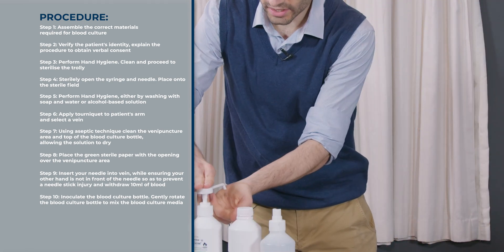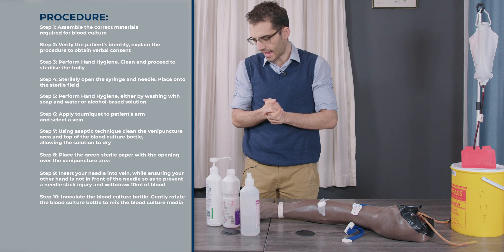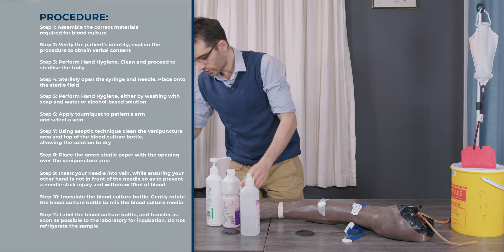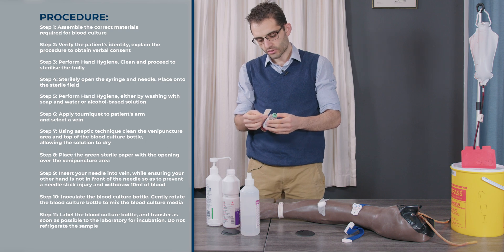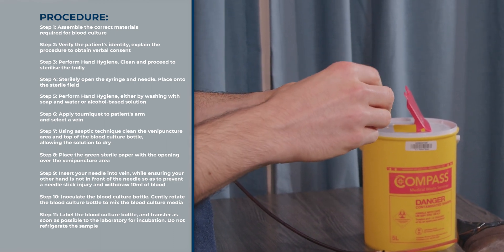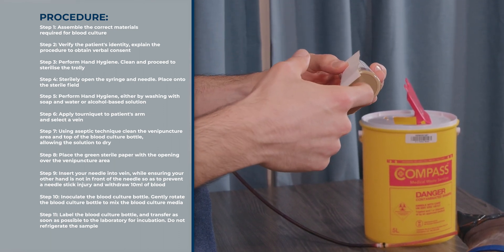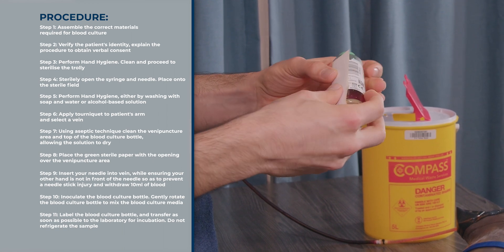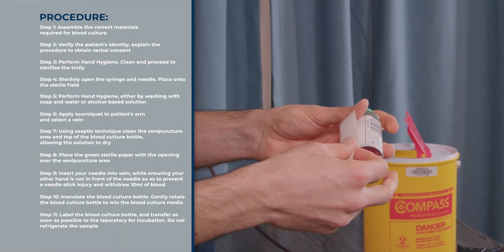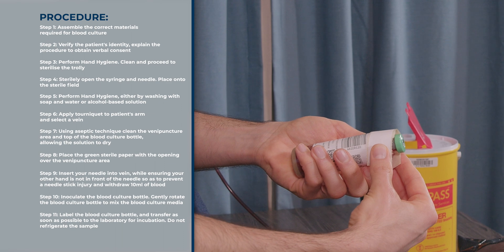Do your hand hygiene and also very importantly thank the patient for allowing you to take blood. Then you need to label the blood culture bottle. When labeling, there is a designated area for your sticker. Make sure you don't cover the bottom of the blood culture bottle, because the machine detects growth by looking at the bottom. Also don't cover the barcode area, as the machine won't be able to read it. Your options are to stick the label along the side or right at the top.